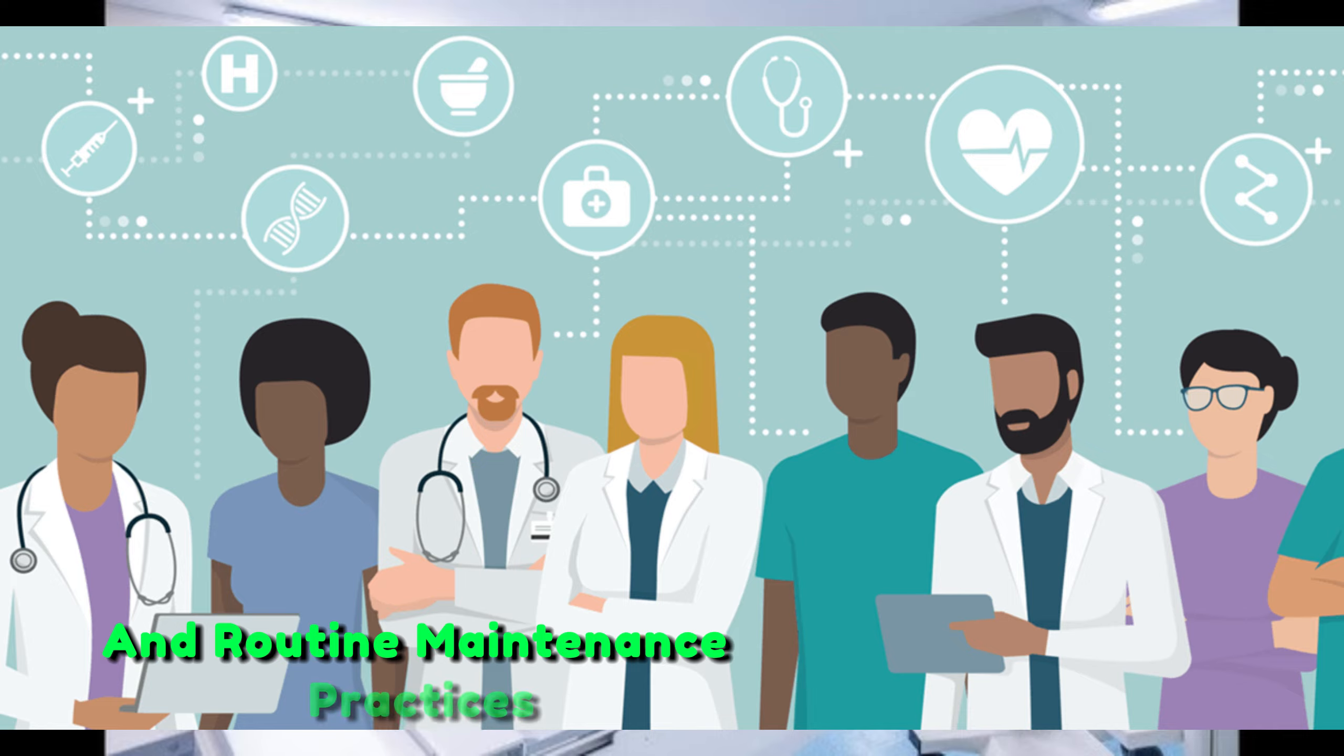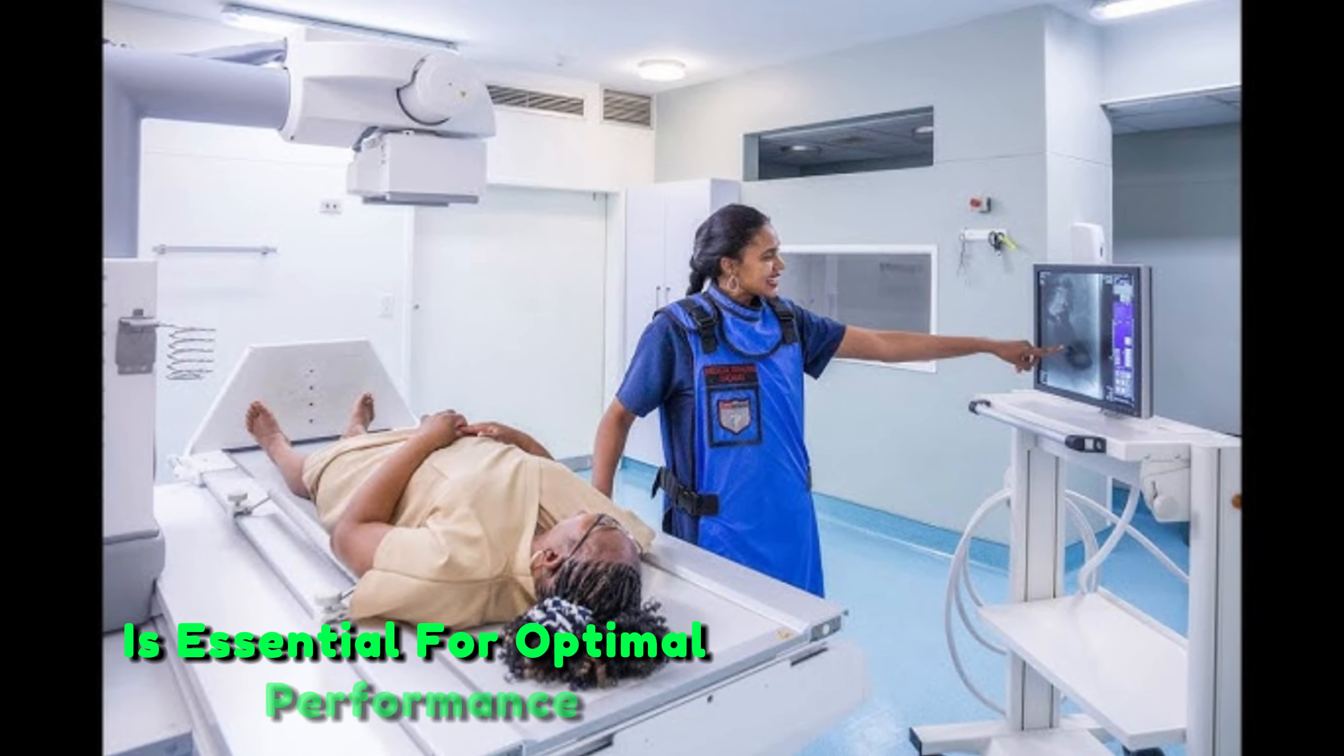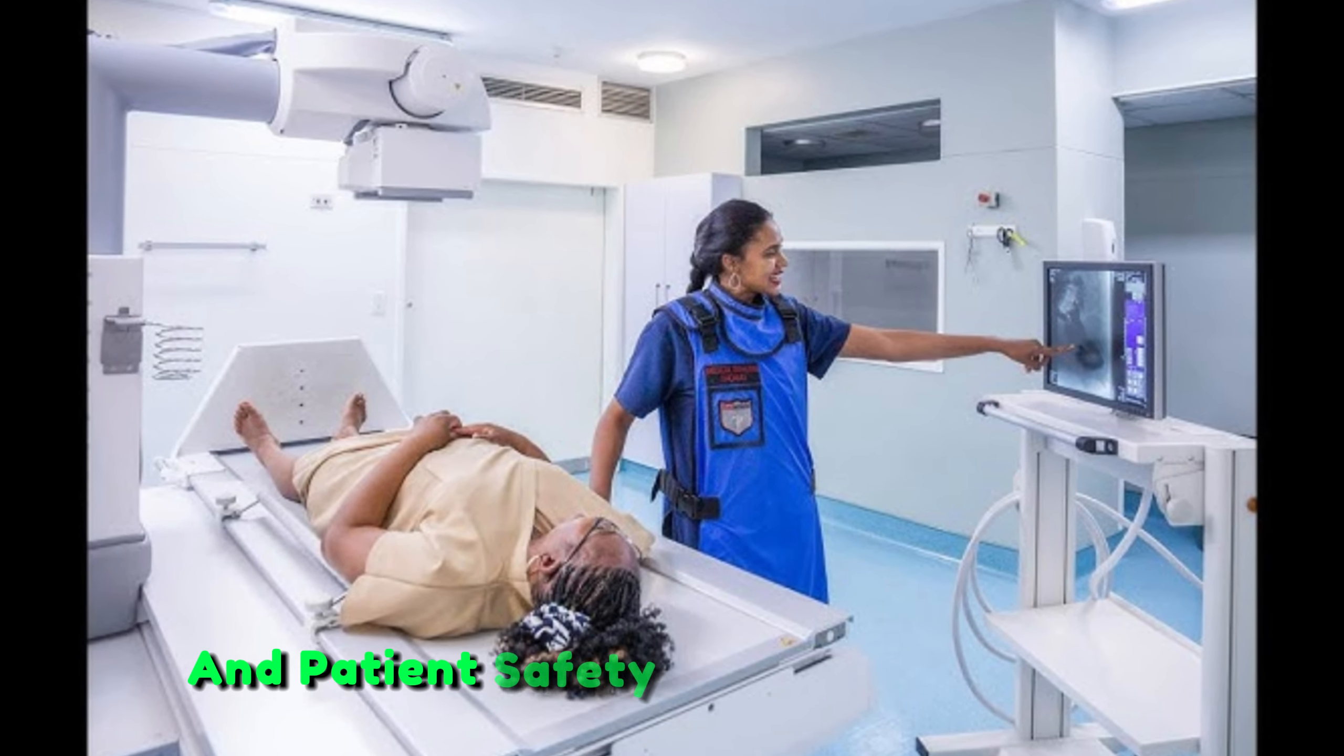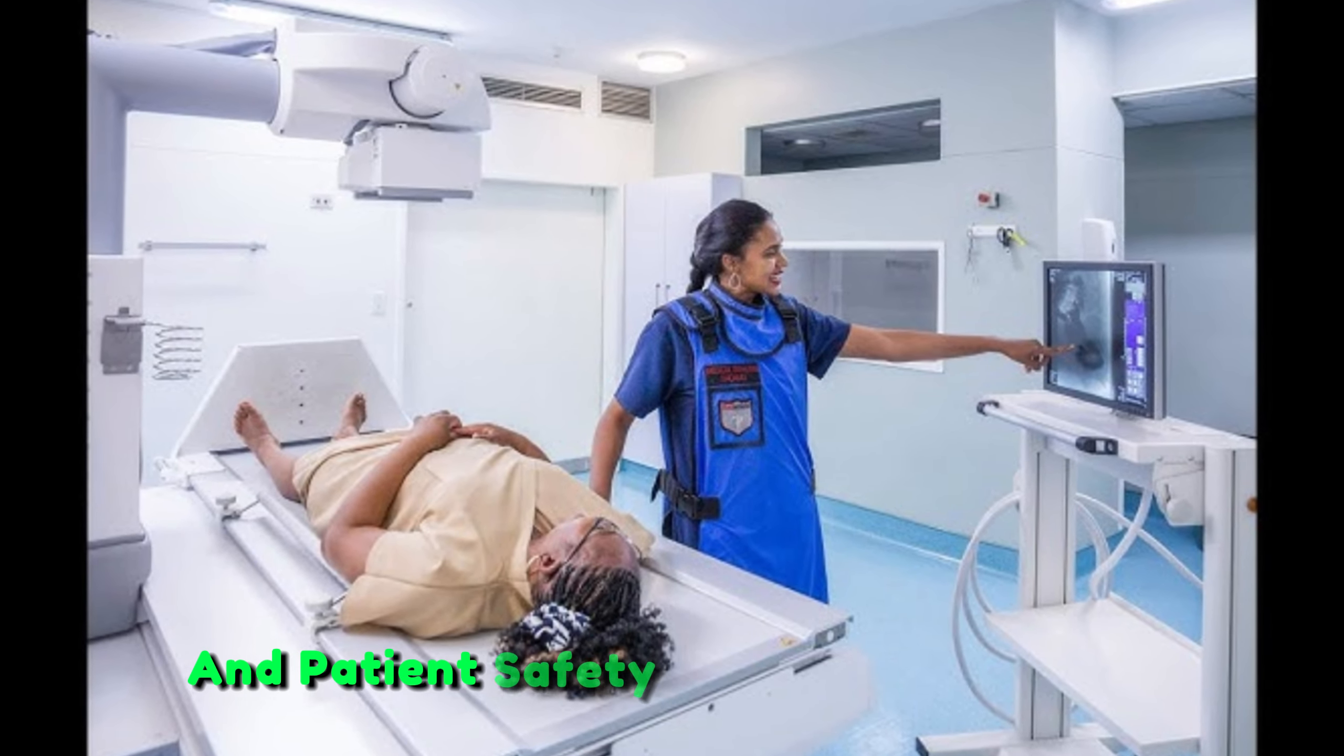Regular training for x-ray technologists on troubleshooting procedures and routine maintenance practices is essential for optimal performance and patient safety.